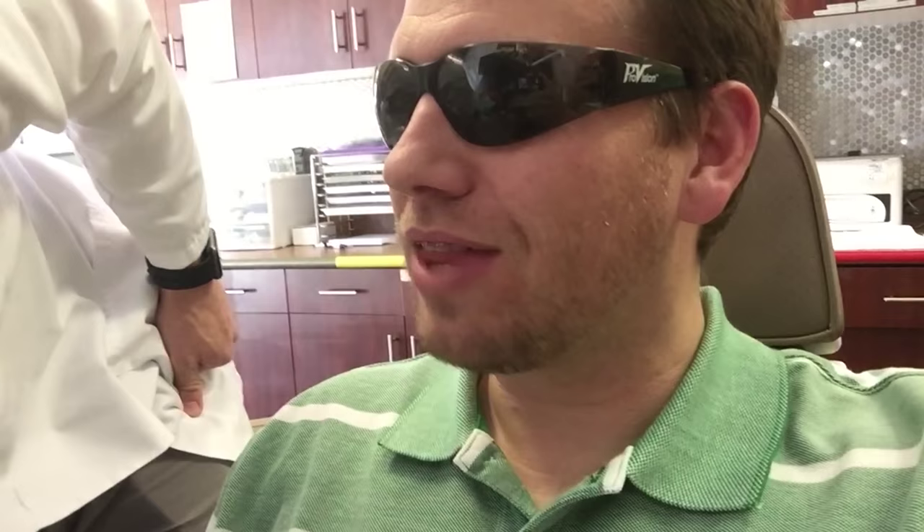So I'm going in right now and I'm going to get these bad boys off. The orthodontist checks my bite — "Let's see you bite down. Okay. Happy with how everything looks? You ready to do this?" Let's do it!